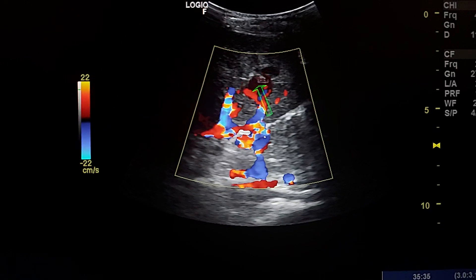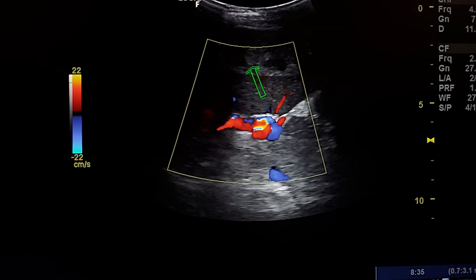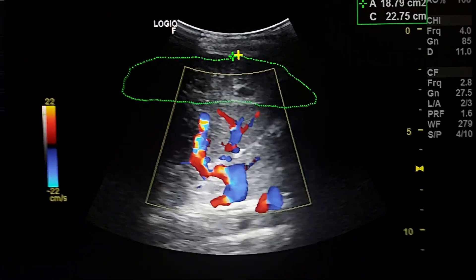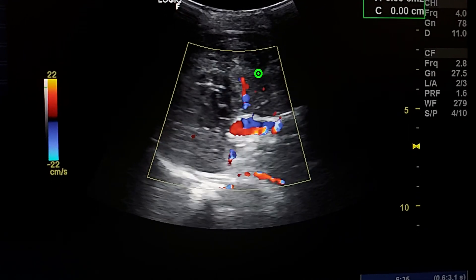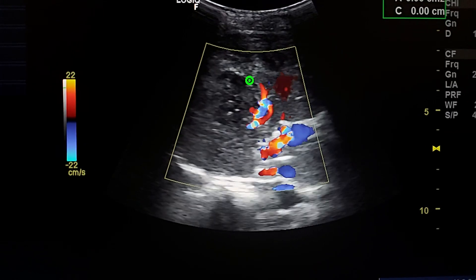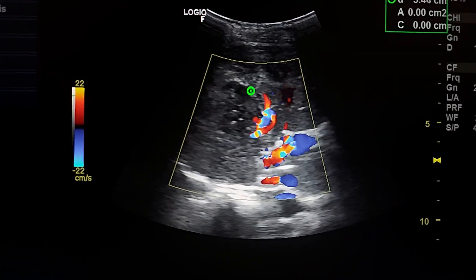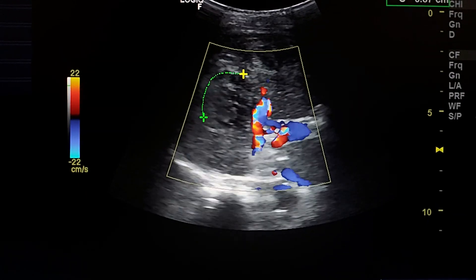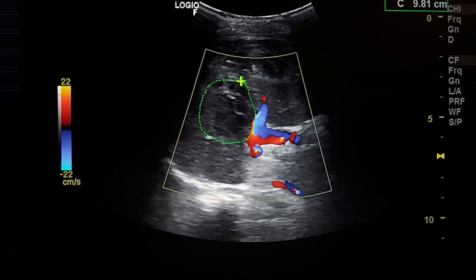This echogenic line is the splenic capsule, and this thickness is the subcapsular hematoma, which follows the splenic capsule to the superior pole. Here we see a circular hypoechoic area. We don't see the splenic capsule here, so this area is an intraparenchymal hematoma, and the subcapsular hematoma originates from it.